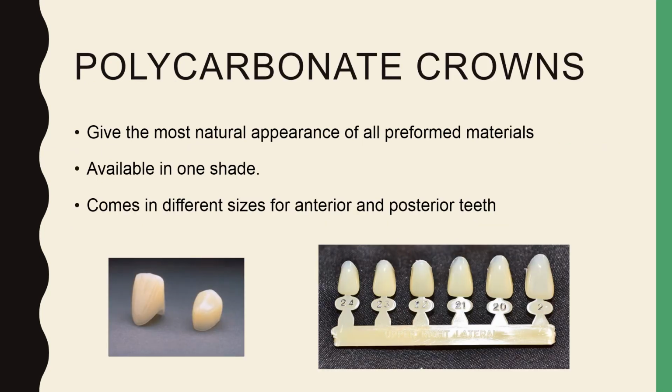The polycarbonate crowns give the most natural appearance of all preformed material. They are available in one shade and can be modified to a limited extent by the underlying lining resin color. They come in different sizes for anterior and posterior teeth.